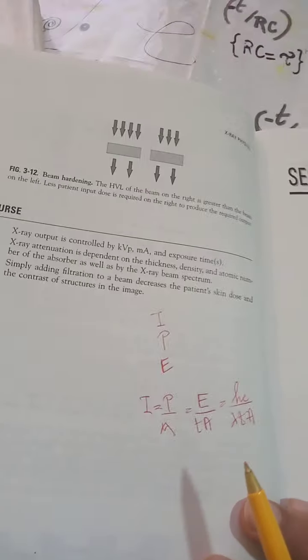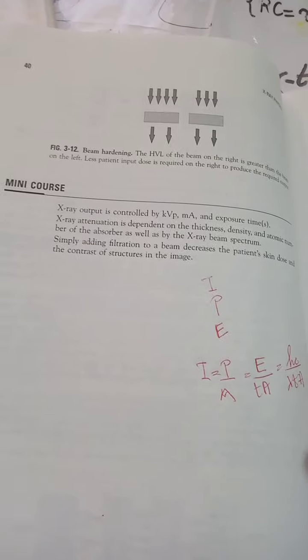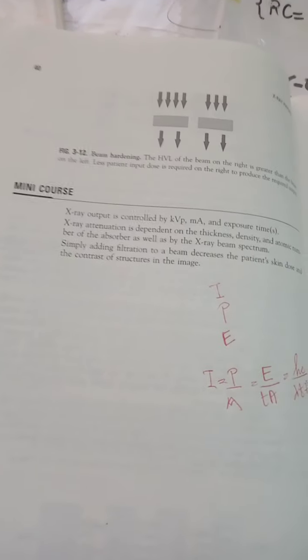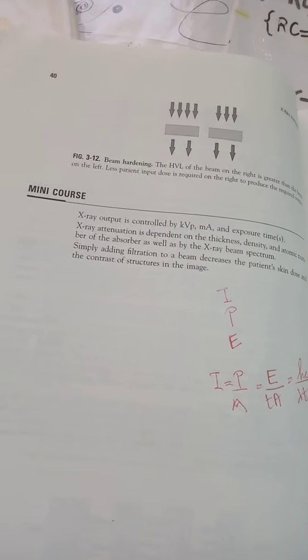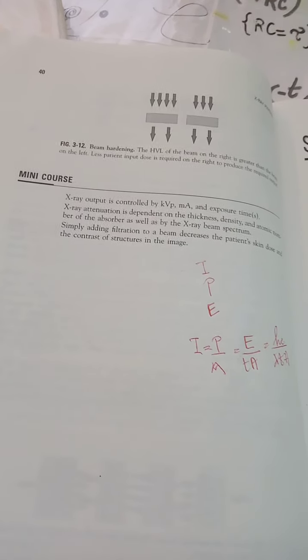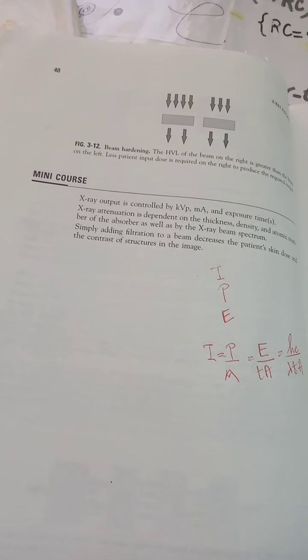It's been a very cathartic experience to learn about the impact of voltage and current, how it interacts with contrast, the role of aluminium, and how mu, density, thickness, and Z are linked to it in this whole process. Thank you very much for staying with me throughout the video, and I hope you progress in your understanding of radiodiagnostic operational schemes.